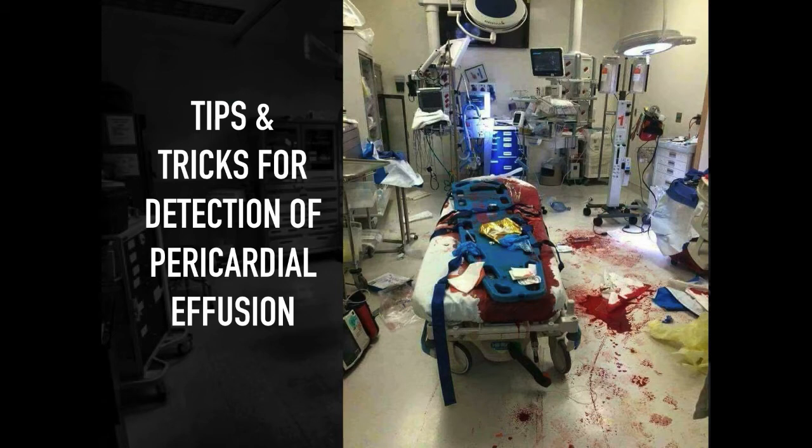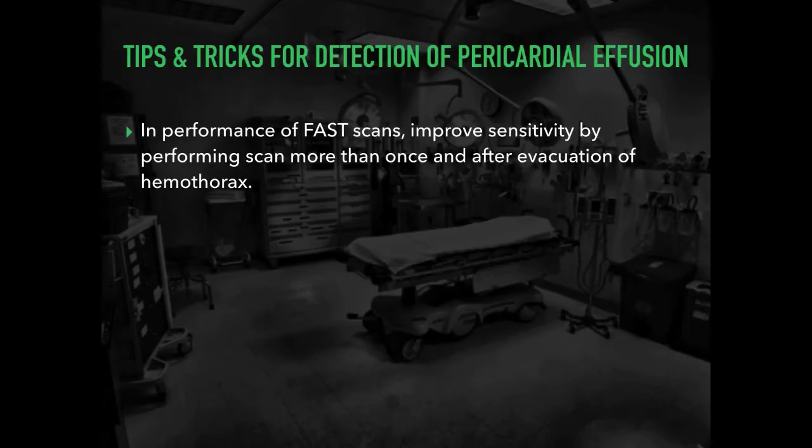Patients with blunt penetrating chest trauma, sternal fractures, hemodynamic instability, and unexplained persistent shock out of proportion to injuries are likely the highest risk of injury to the cardiac structures and resultant pericardial effusion. If you are significantly concerned, then I would suggest you involve your colleagues in cardiology sooner rather than later to help weigh in. Just like other segments of the eFAST examination, you can improve sensitivity by performing the scan more than once, and furthermore after evacuation of a hemothorax.